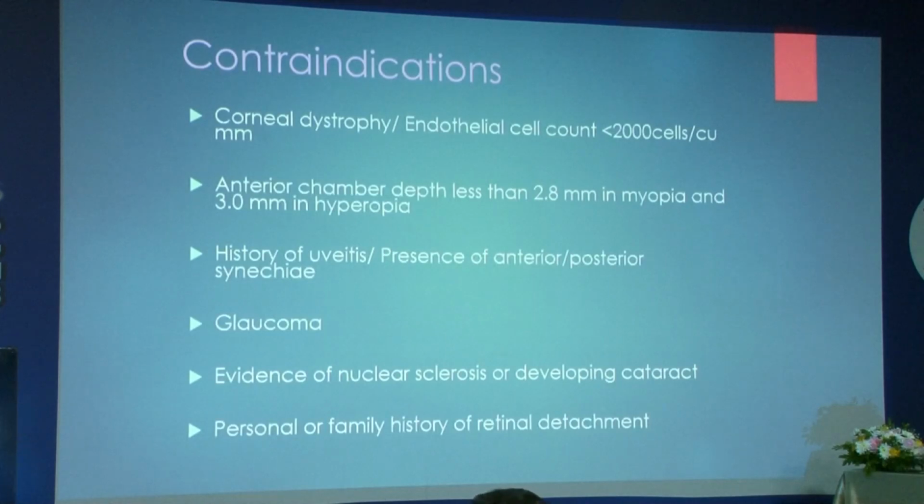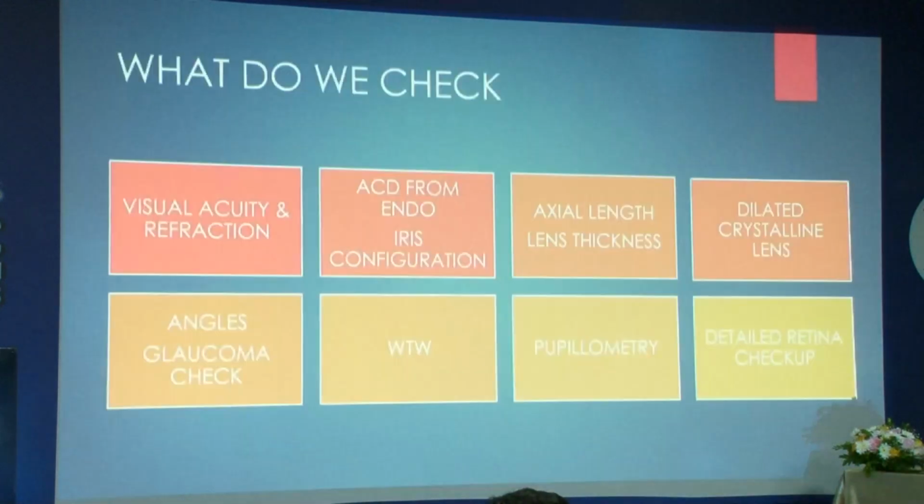And any personal or family history of retinal detachment. This is important because there are studies that show that the risk of RDs increases after you have entered with a phakic IOL in very high myope patients.